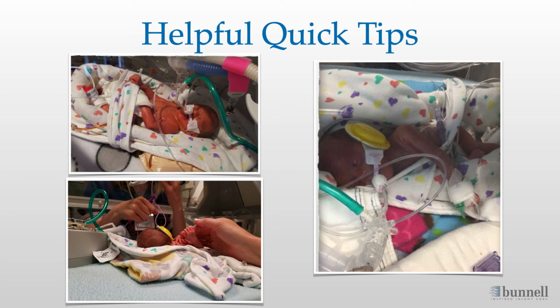As patients get stronger, you may notice larger pressure fluctuations caused by increased respiratory effort. Allowing spontaneous breathing is beneficial to the patient as it allows them to utilize respiratory muscles, preparing them for extubation. Remember, spontaneous breathing is the point of the exercise.